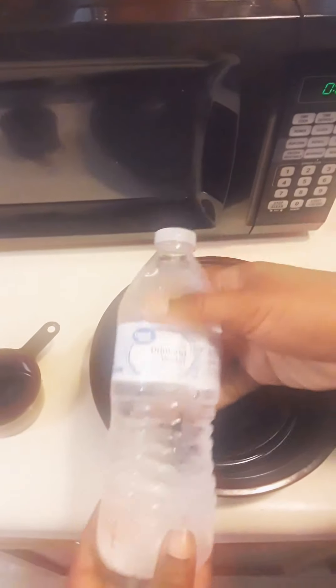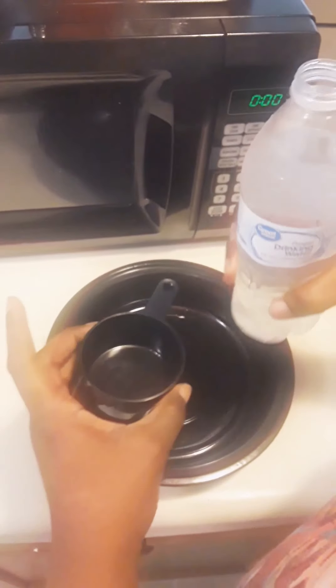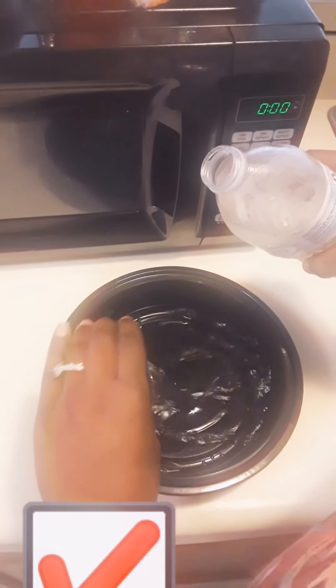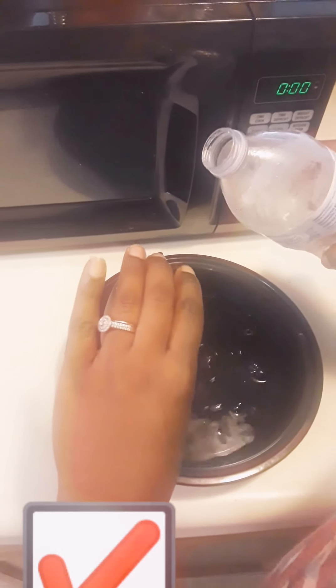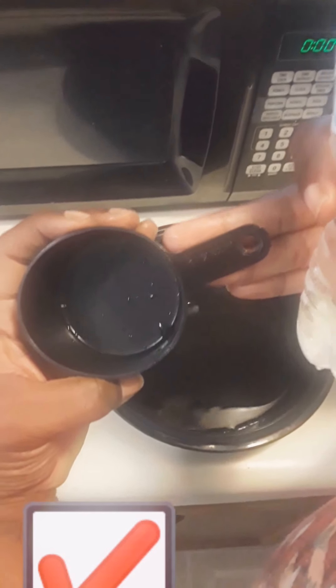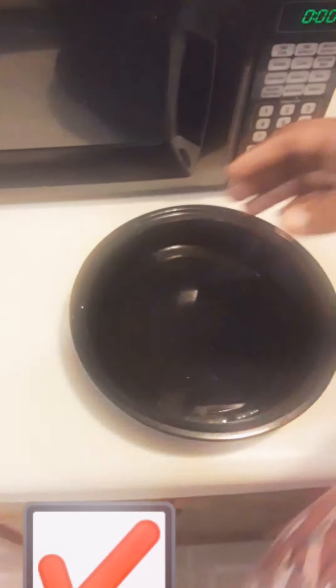The bottled water is still cold and I need it to be lukewarm. I'll open it and use my measuring cup — I need two half-cups because this measuring cup is a half-cup. Two half-cups make one whole cup, which is eight ounces. I'll use the rest of the water to drink since I'm thirsty.